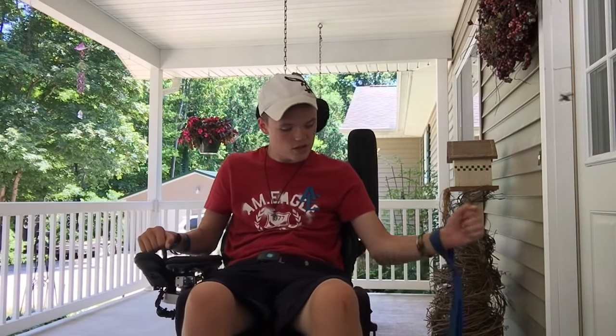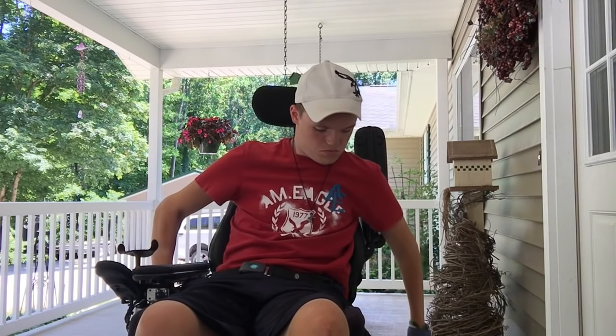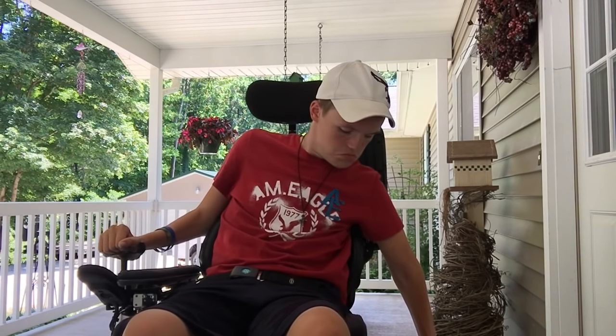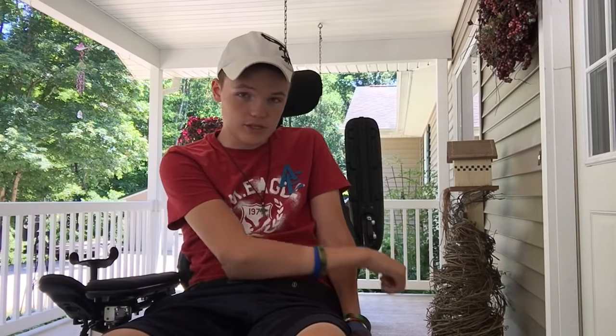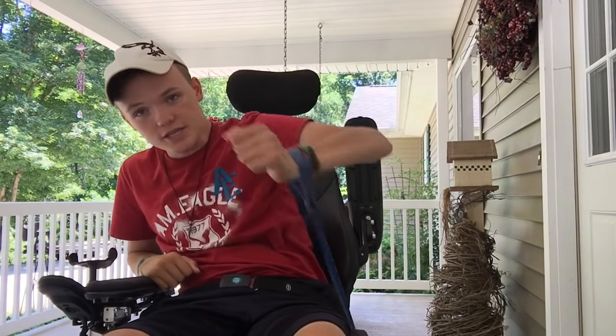And another one that you can do, which I actually thought of an idea here. Okay, so what I did was I made it to where my back wheels are facing that way rather than up here, which gave me room to put this band in. And I'll go forward until my back wheels are on the band. If you want to work your biceps, you will use the arm that's closest to that band, like this, and you'll go back over to the left, and then straight up to the other side, and it works the biceps.